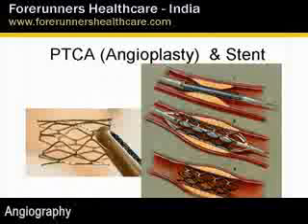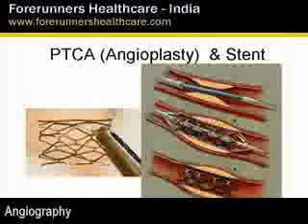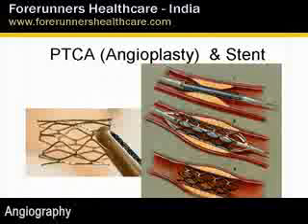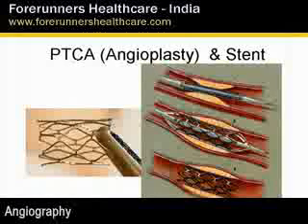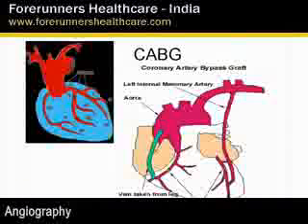A stent is basically a wire mesh which is initially in a collapsed state, and it is inserted into the place where there is a blockage, and there it is made, just like a balloon, to inflate. The mesh is made to open up, and it then keeps the lumen patent. It keeps the particular artery's blocked part open for a longer period, which otherwise would have had a tendency to get re-stenosed. So basically a stent, or even a medicated stent which releases certain medicines, remains there and prolongs the life of the angioplasty.